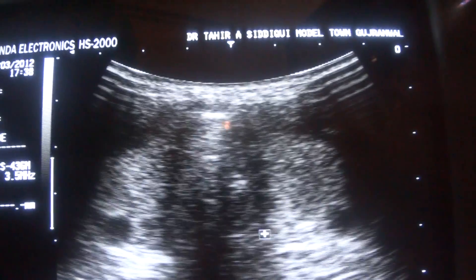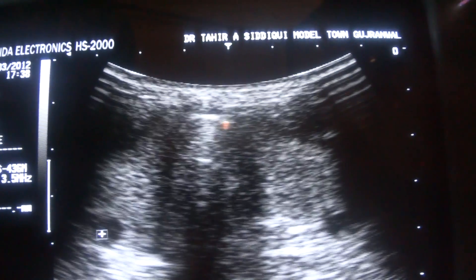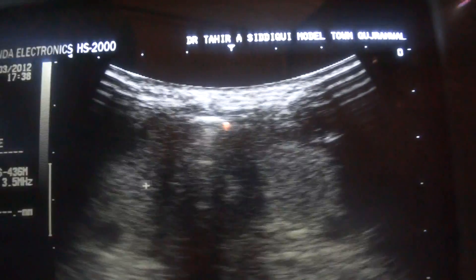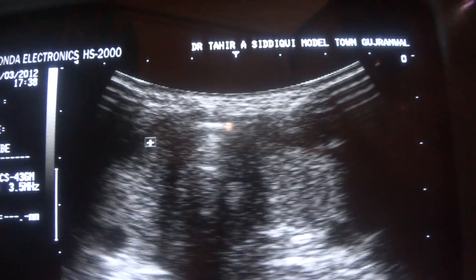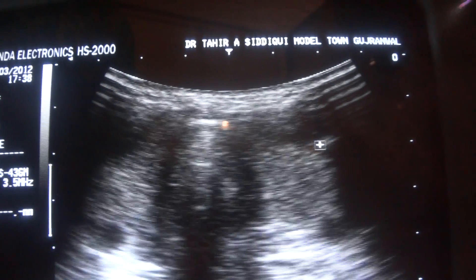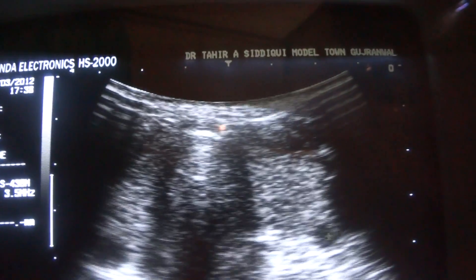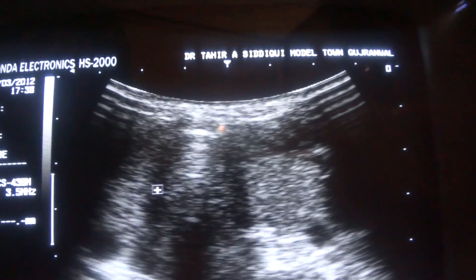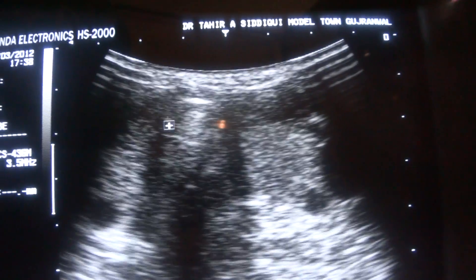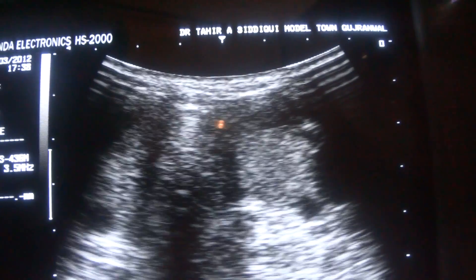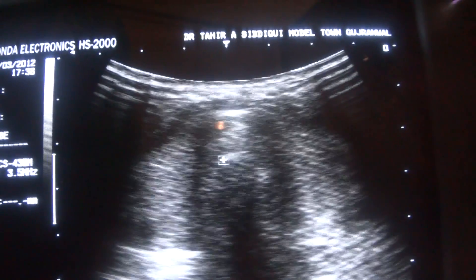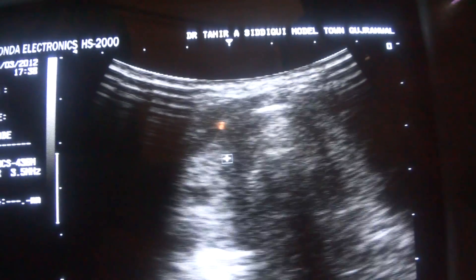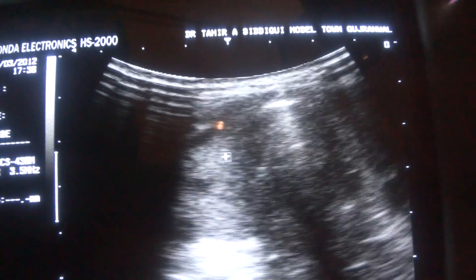The landmark for identification of the lobes in transverse section is the common carotid artery. This is the left lobe of the thyroid with carotid arteries as landmarks. These are the tracheal air shadows. Now, first going towards the right lobe in transverse section.